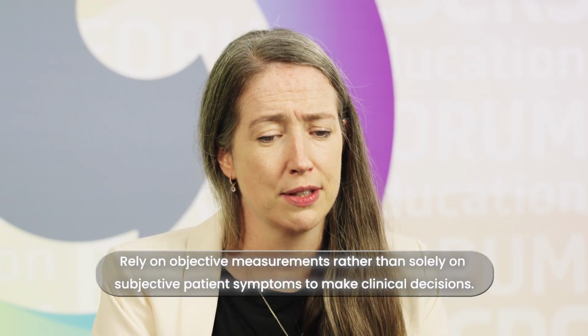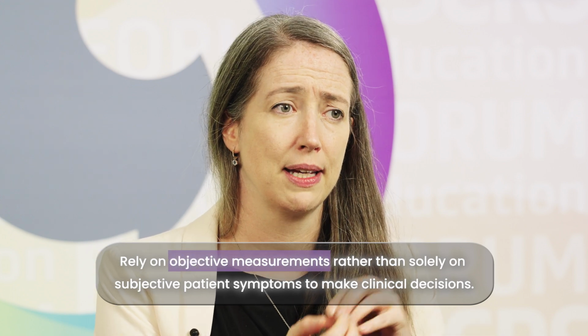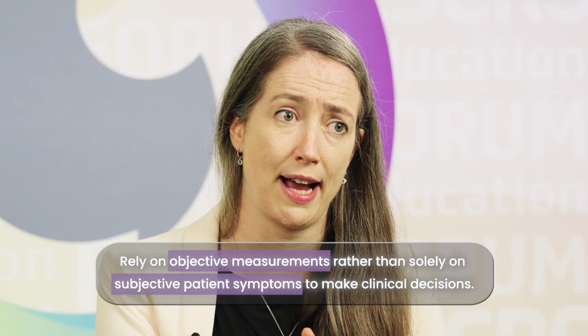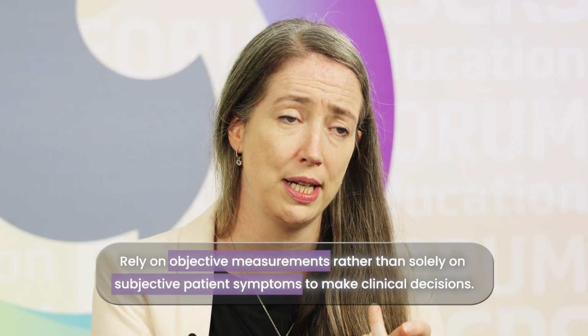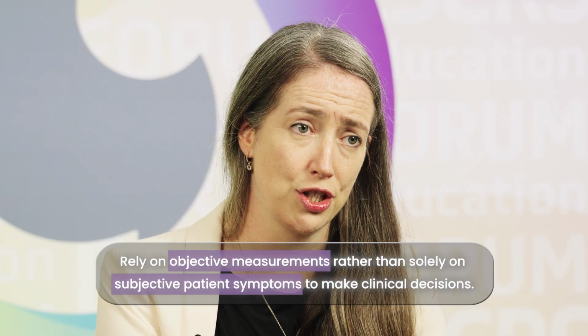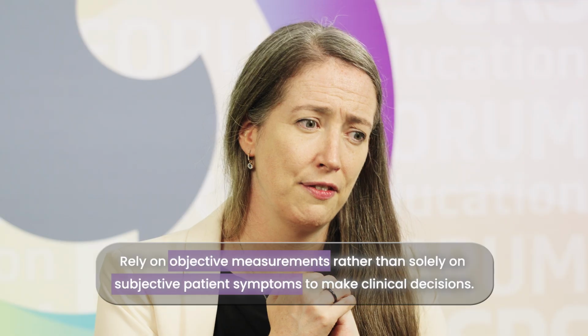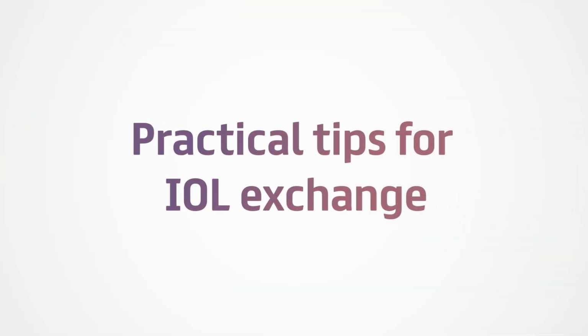The second part is indeed trying to put the patient's symptoms into an objective measurement, because patient's symptoms alone can be difficult to advise one course of action versus another. But once you see on the aberrometry and you see on the retroillumination that lens is in the sulcus, then you have a much firmer ground to stand on when you make your advice to the patient.